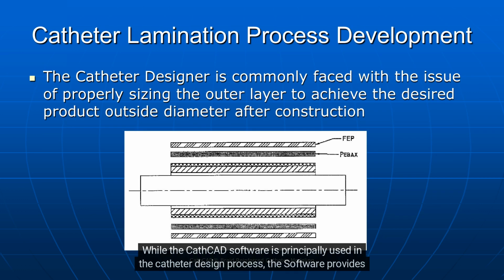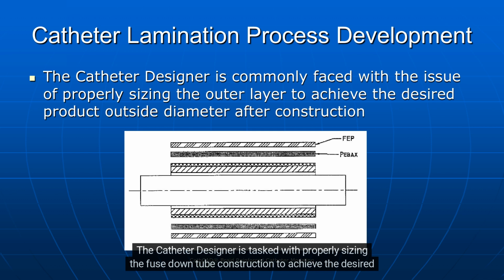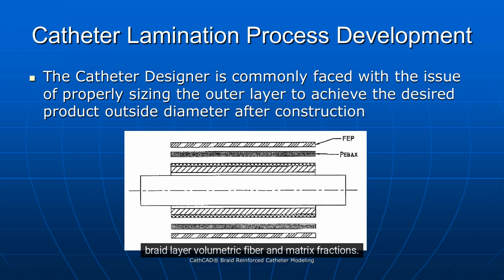While the CathCAD software is principally used in the catheter design process, the software provides a catheter lamination designs utility program that is useful for the manufacturing engineer. The catheter designer is tasked with properly sizing the fuse-down tube construction to achieve the desired product outside diameter after construction. The CathCAD software calculates all relevant properties in the catheter braid configuration, including the braid layer volumetric fiber and matrix fractions. These parameters are necessary inputs to the fuse-down designer.